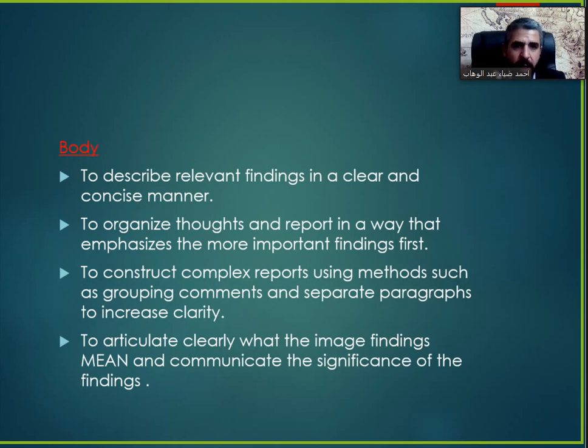We don't just write paragraphs one after the other, and we have to articulate clearly what the image findings mean and communicate the significance of the findings. The referring physician will not care if you say there is a T2 hyperintensity in, I don't know where. What does T2 hyperintensity mean? You have to say that so that you make sure that he understands.